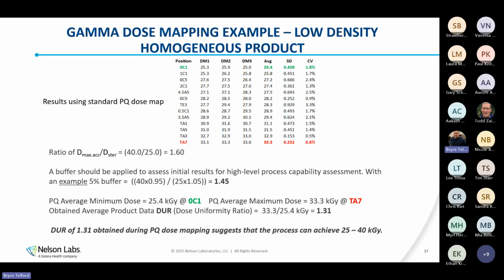Or let's say we only validated our max dose to 50 kilogray, we can try increasing that to an even higher dose. Now, of course, there's trade-offs with all of these. If I have an irradiator that's just down the road, but it's not process capable, and an irradiator 2 states over is process capable, well, now I've picked up a whole lot of shipping costs and a lot of shipping logistics that go with that. So that may not be the best option.